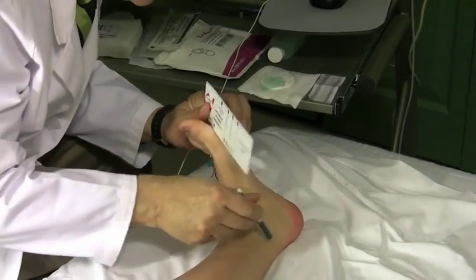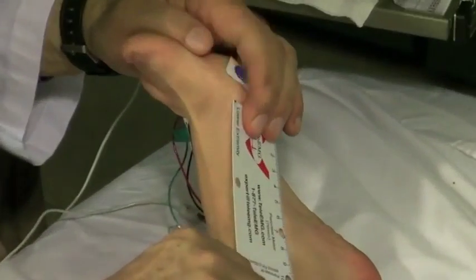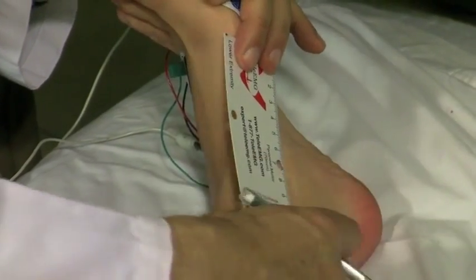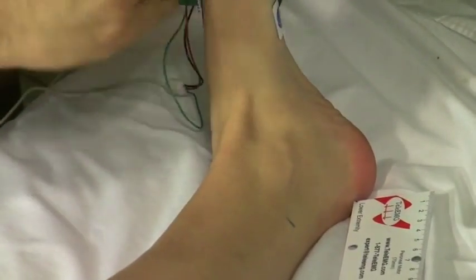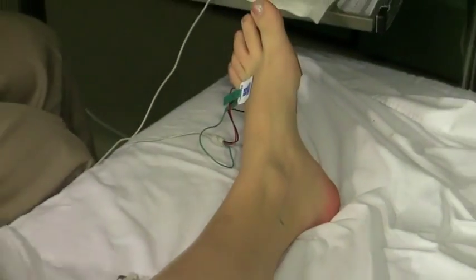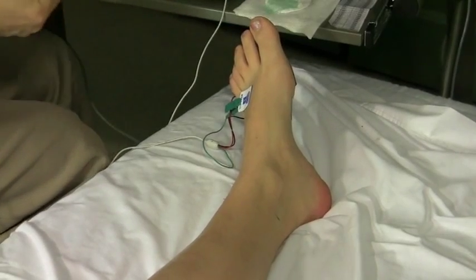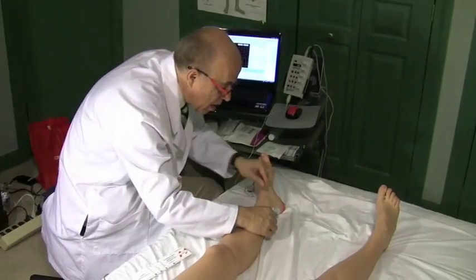And the tibial nerve I stimulate right here. Okay, so now I need to measure 14 centimeters. Put that mark over there. And relax your foot. Excellent. And now we are positioned over the tibial motor left. So I'm going to stimulate here.